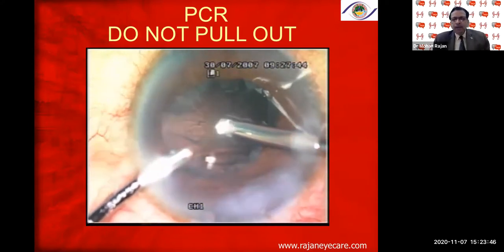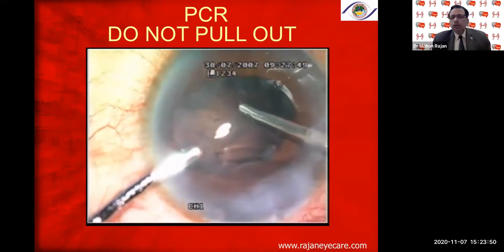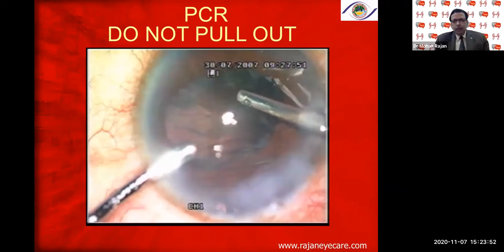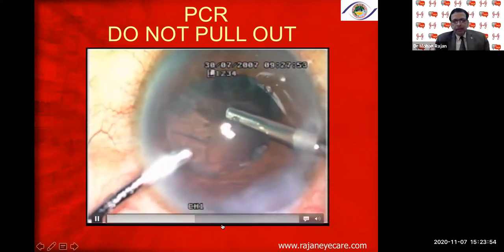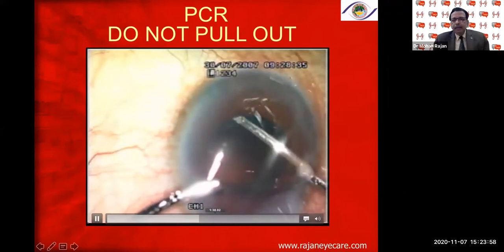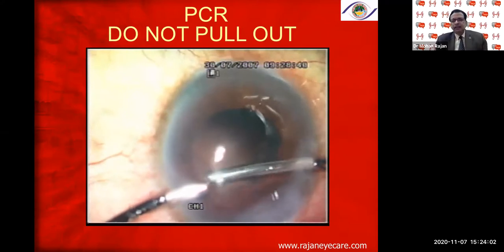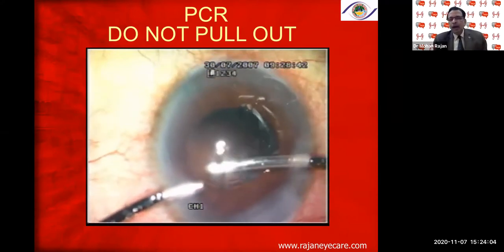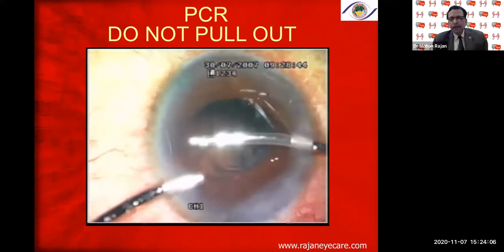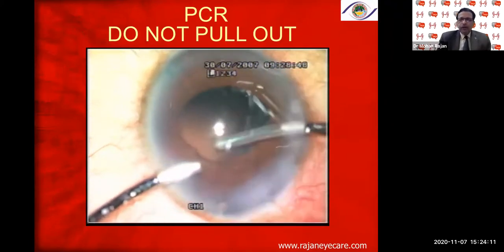But more importantly, with bimanual, always remove the vitreous first and then remove the cortex and the epinucleus. Once I had done that, I removed the cortex and then went ahead with the implantation of a Sensar acrylic 3-piece lens in the sulcus, and the patient is still doing very well after a 13-year follow-up, mainly because I followed all the protocols when you have the PCR.